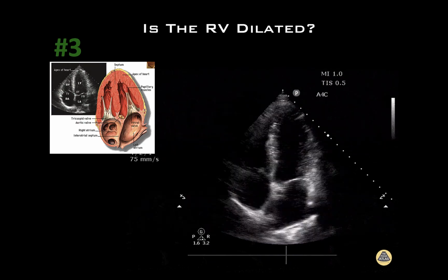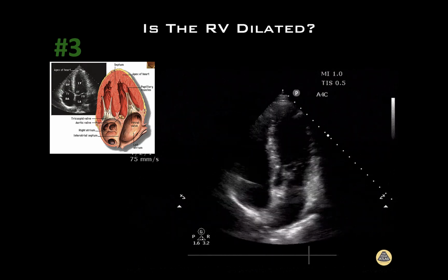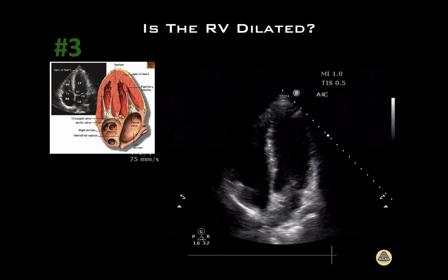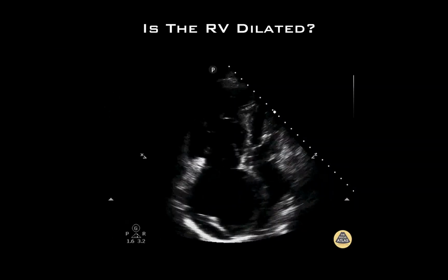The RV is normally less than 2/3 of the size of the LV in apical four-chamber. When the size is equal to or larger than the LV, right ventricular failure should be suspected. Here is a normally sized RV in apical four-chamber view. Here is an example of a large RV.